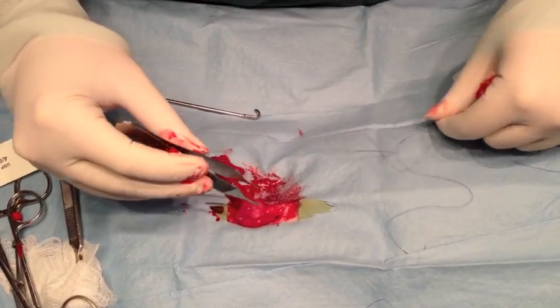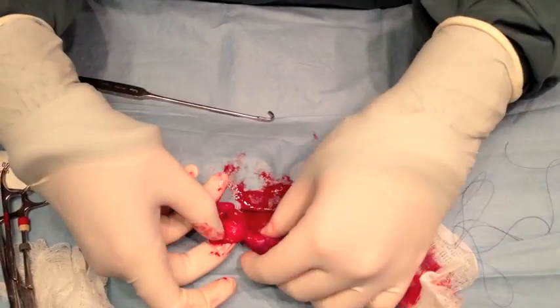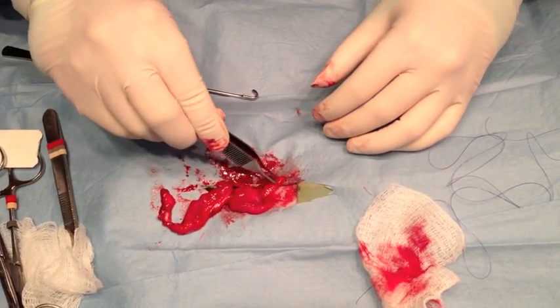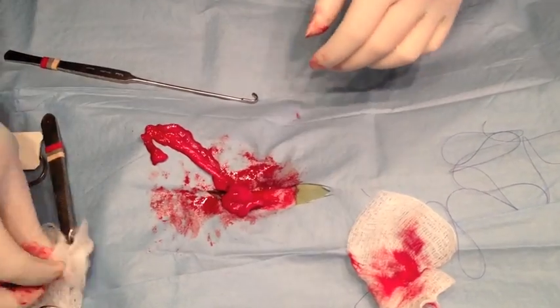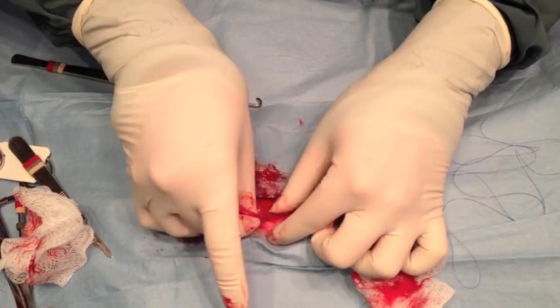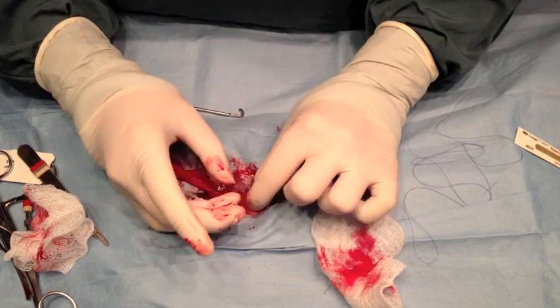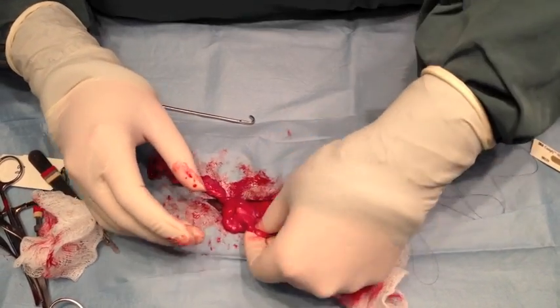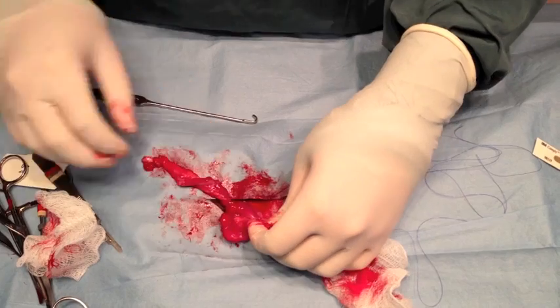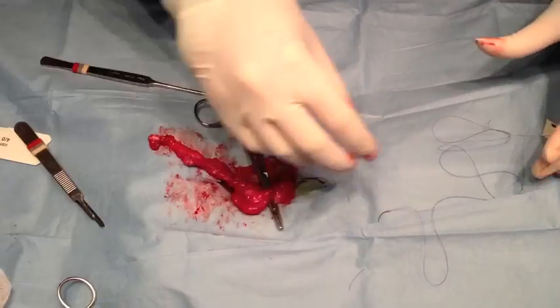Since I'm not really clamping anything, you will see that it just tends to be a little bloodier than if you were doing a cat spay. Now here I'm going down, pulling off some more broad ligament, and I can easily find the other horn — it's already sitting out. It's very easy to follow it around and find the other horn, and I'm basically going to be doing the same thing on the other side, very gently pulling out the ovary. That's the left side of the bunny, which — the same as in a dog and cat — the left side is easier to pull out because it's a little more caudal.